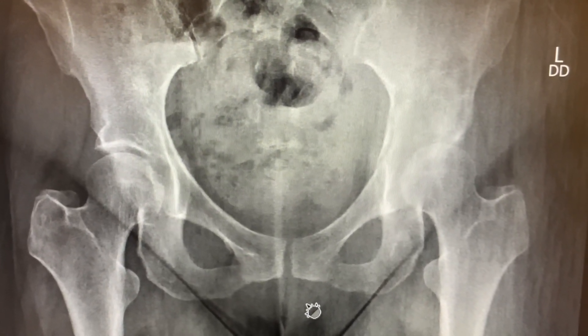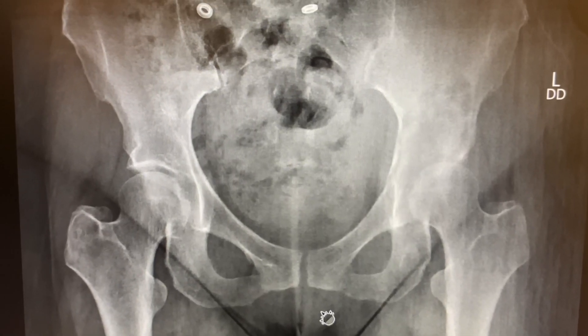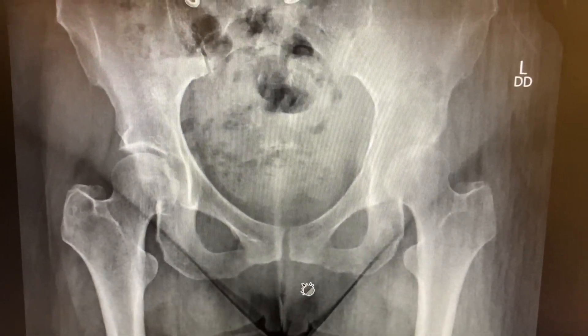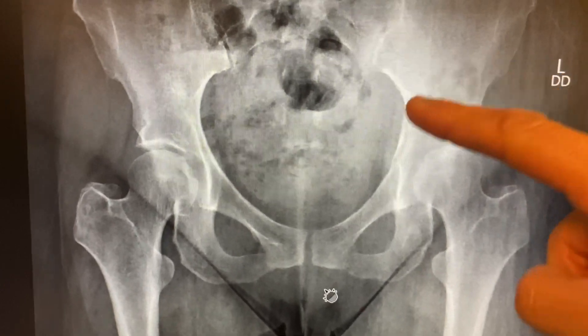People always think that x-rays don't show you enough and you have to do an MRI. Well, here is a case where you don't really need an MRI to know that there's a serious pathologic malignant condition going on. There's your view — you should see the pathology right away. Right here: lytic lesion.